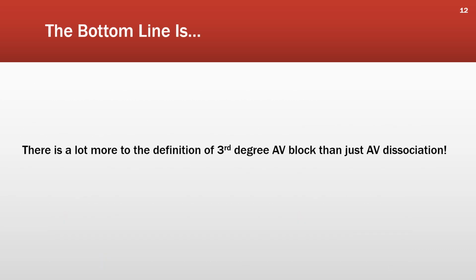So the bottom line is this. There's a lot more to the definition of third degree AV block than just AV dissociation. If you're reading a book or an article or watching a video on the web that defines third degree AV block simply by the presence of AV dissociation, they don't know what they're talking about. There is a difference between pure AV dissociation and AV dissociation caused by a third-degree AV block.